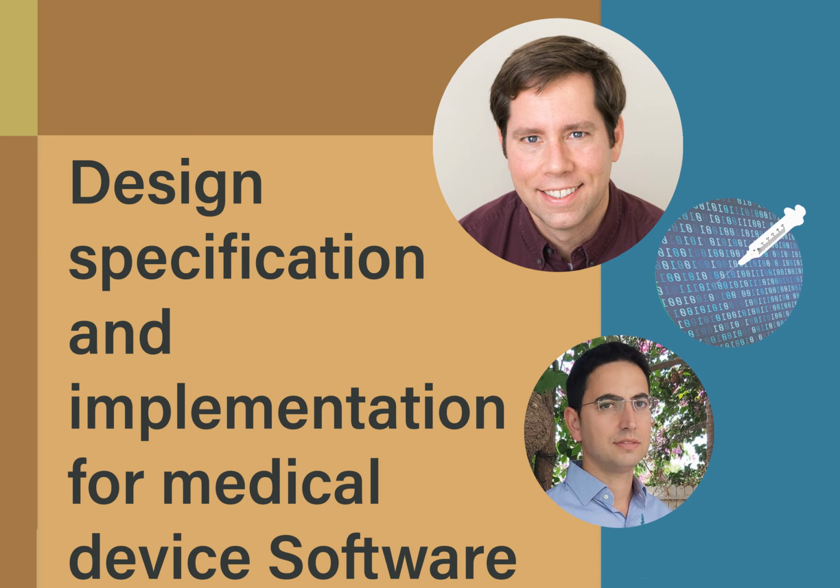But nonetheless, before you can produce a detailed design, you need to have requirements defined. And before you can define requirements, you need to have user needs and intended use. And so that's the design inputs versus outputs.